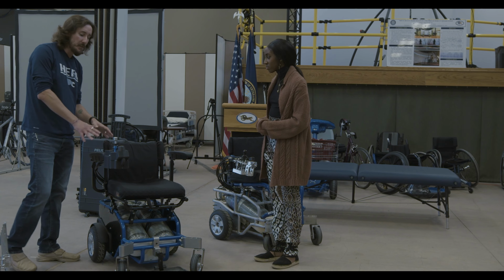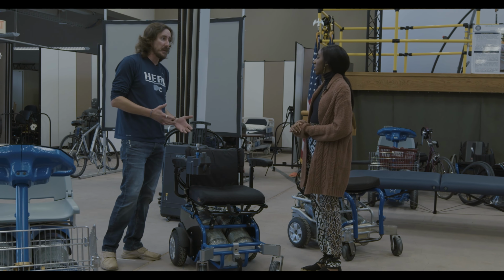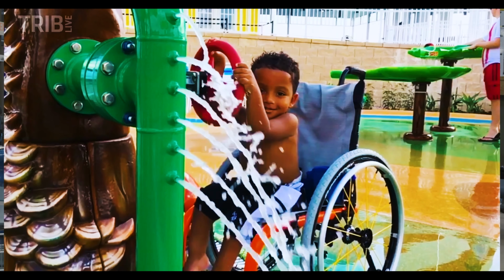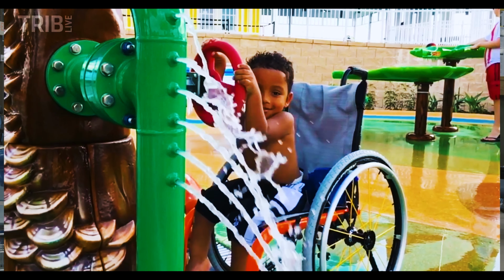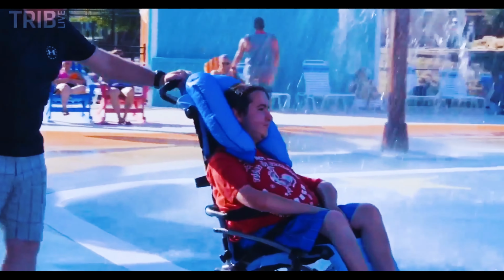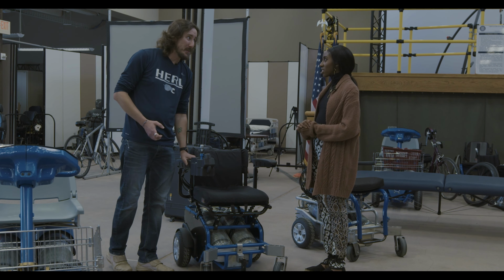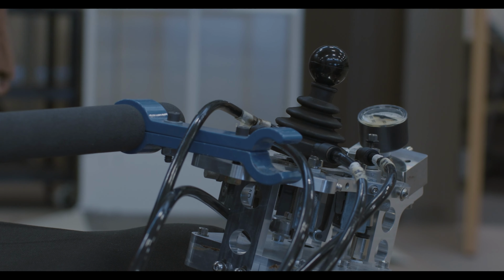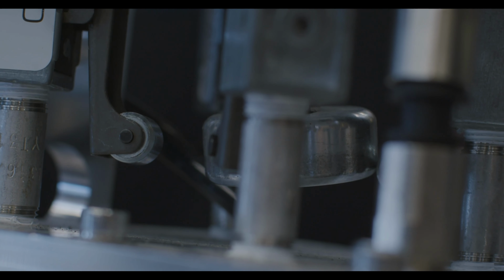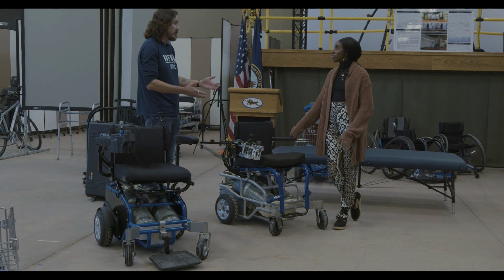So, the new chair was originally designed just to figure out different ways to power chairs, but then we were contacted by a private group that wanted to see if we had any way of making a power wheelchair that could get wet, that could go through water without shorting out, without putting the user in any sort of danger. We said, hey, we definitely got something for you. And you can see how just moving the control stick around operates these little tiny switches. Each time one of those switches is operated, it tells the pneumatic lines to take some air pressure and put it to the wheels.